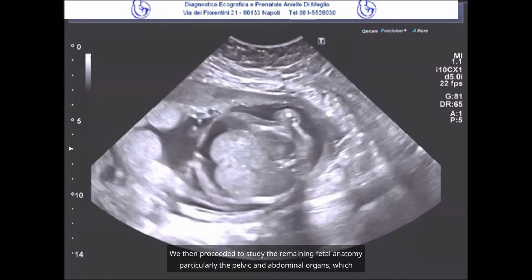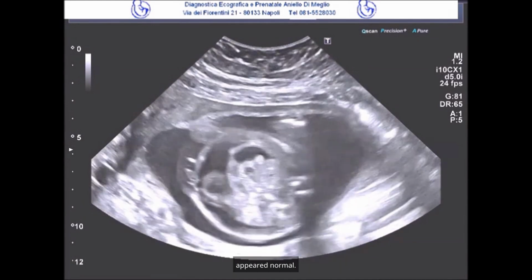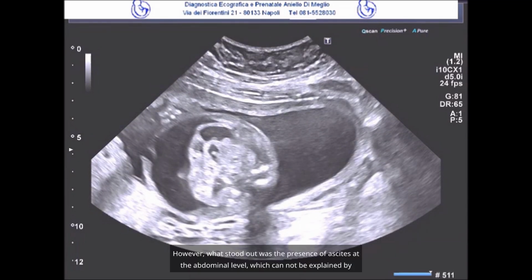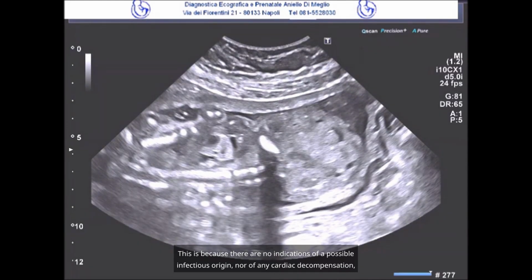We then proceeded to study the remaining fetal anatomy, particularly the pelvic and abdominal organs, which appeared normal. In fact, we can see in sequence the bladder, the liver, the stomach, and the kidneys. However, what stood out was the presence of ascites at the abdominal level, which cannot be explained by anything other than the teratoma itself. This is because there are no indications of a possible infectious origin, nor of any cardiac decompensation, which has in fact been ruled out.